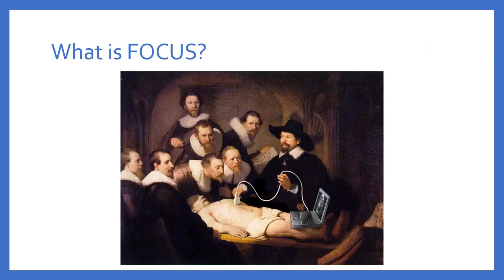First of all, focused cardiac ultrasound refers to the use of ultrasound by the clinician to look at the heart. So at the same time that images are obtained, they're also interpreted, and this is helpful because it allows us to immediately put into practice what we learn from FOCUS. At the same time, FOCUS can easily be repeated over time so that we can see what's happening with our patient as the disease process evolves.